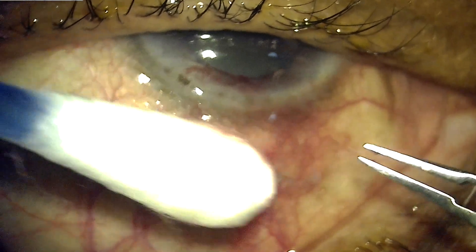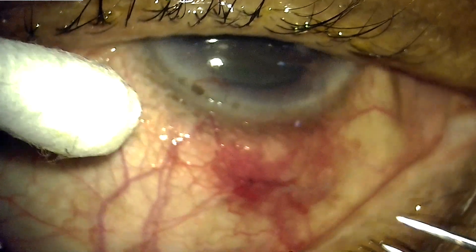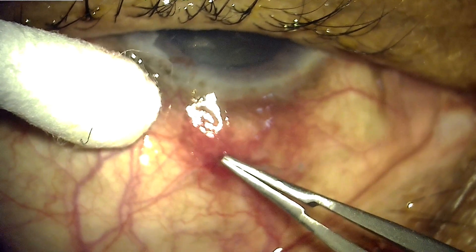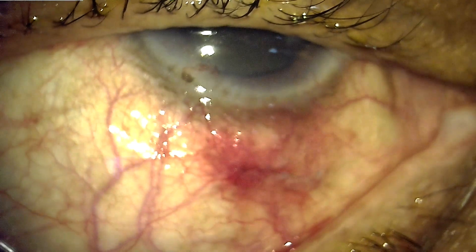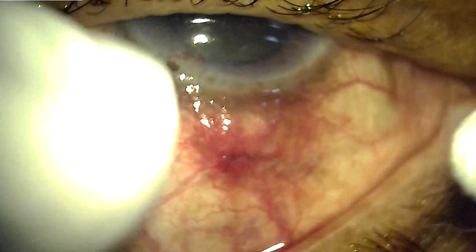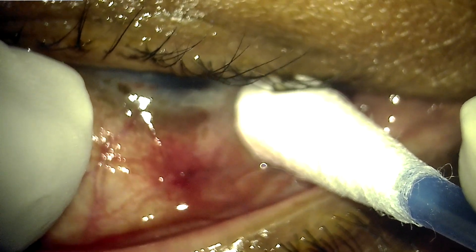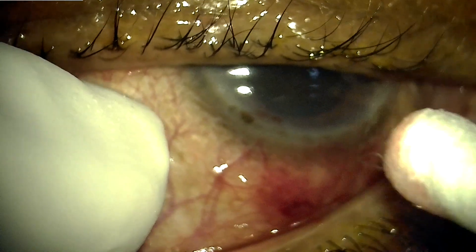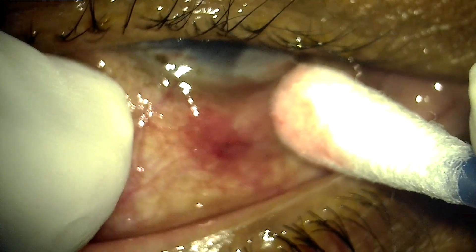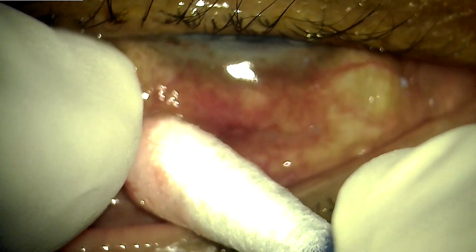The knot has been resolved. Once the suture has been pulled out, it is important that one massages the eye and the bleb itself, which can facilitate the drainage of aqueous in a regulated way. Here we can see compressing and massaging the eyeball until we can see flow of aqueous coming out from the flap onto the conjunctival area, with some part of it draining out and visible to us.